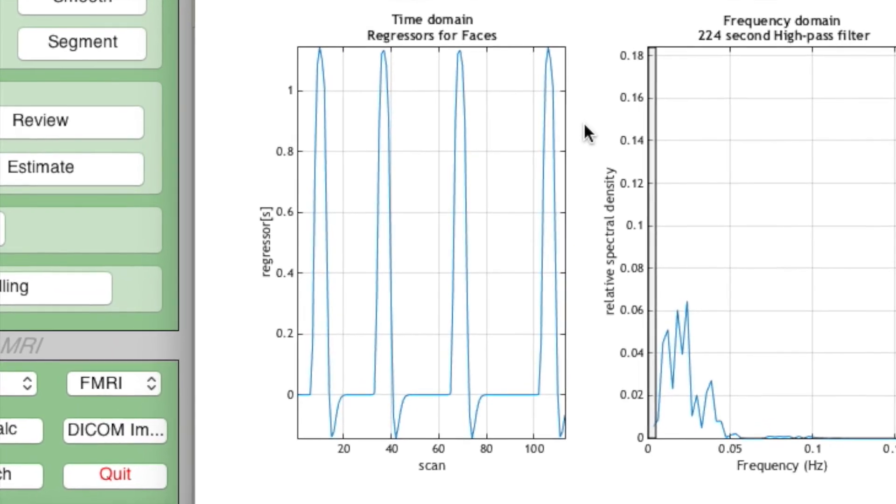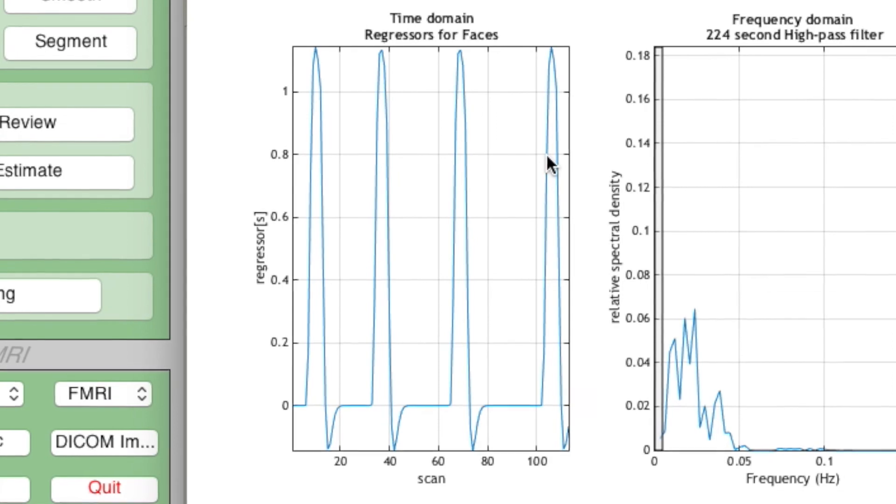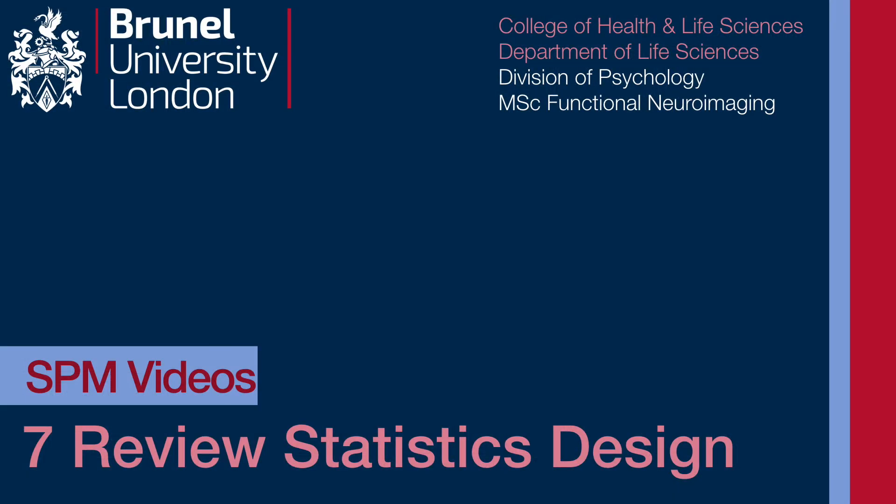Now you have thoroughly reviewed and checked your statistical design, you're ready to get SPM to apply it to your data. That's coming up next.